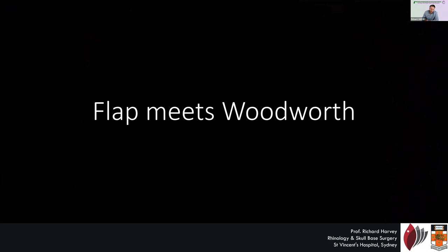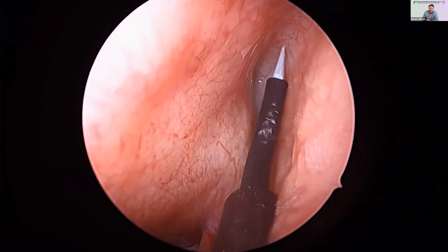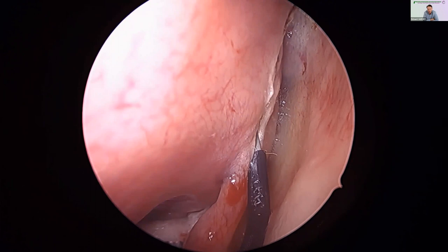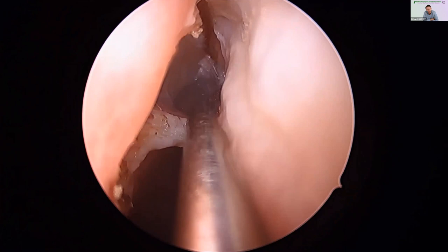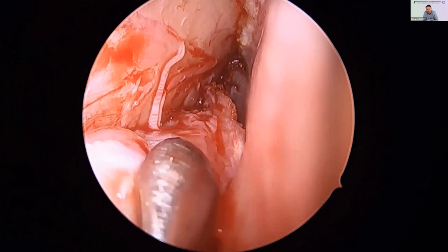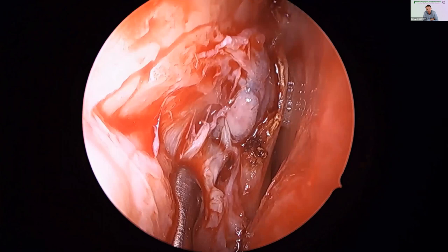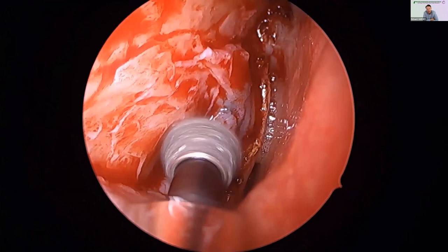I was giving a course in Sydney — this was maybe 2018 — and Brad Woodworth was one of our guests. Brad said to me that you've got to make the flap much bigger, drop it down, and make it inferiorly based. So that's what we evolved to. We now do a flap that starts right up at the top of the nose, we follow the root to the very top, find the piriform aperture, and this flap goes all the way to the piriform aperture and then we fold it down. So it is now an inferiorly based flap, but very broad. When we fold it down, you've got fantastic access and the flap is not in your way.